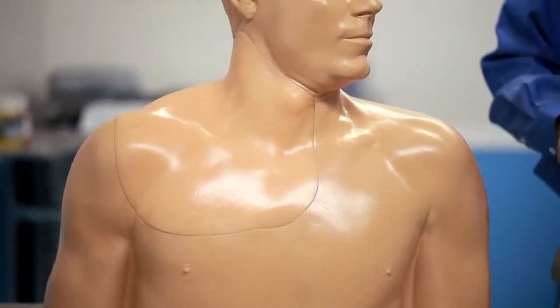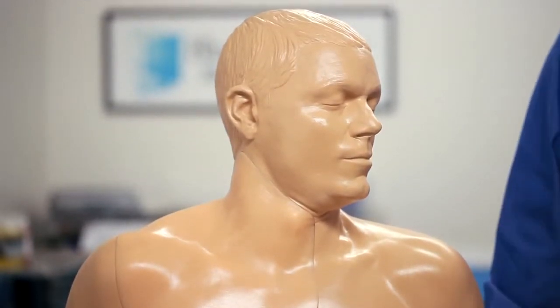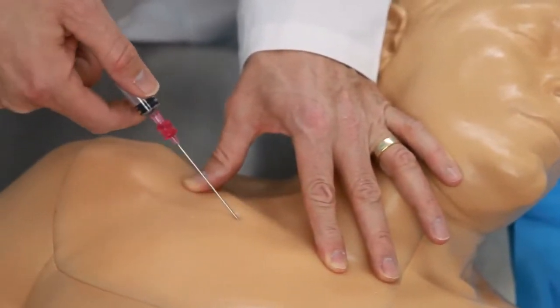I'd like to introduce you to our new upper torso central venous access and regional anesthesia ultrasound training model. This product offers the same realism, quality, and durability that you've come to expect from Blue Phantom. Because of our new live cast modeling approach, the external landmarks are present in great detail.